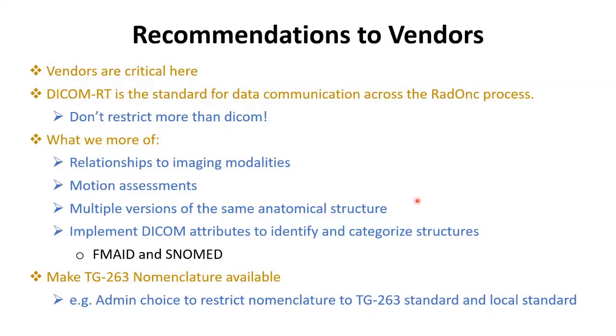You are welcome. Do you usually leave contours that are not used in the plan? For example, in your case, a PTV 70 and 74 and another one 66, but then they decided just to treat the 66 volume. Do you still keep the 74 gray plan? No. I would ask them to delete it from the prescription sheet. We'll keep the one which they choose at the end. The one which is approved, that one we keep. The other will be deleted.